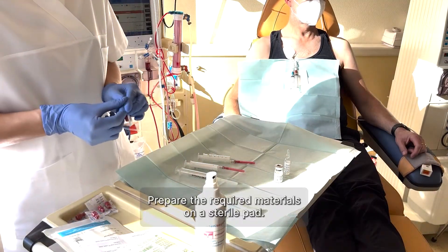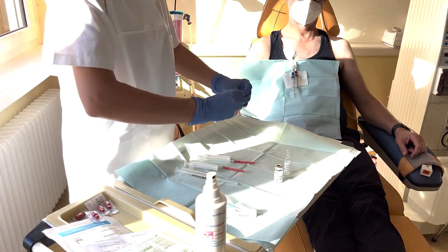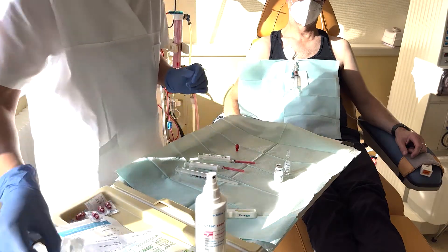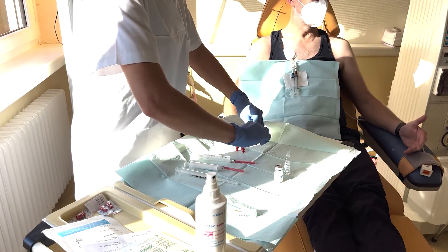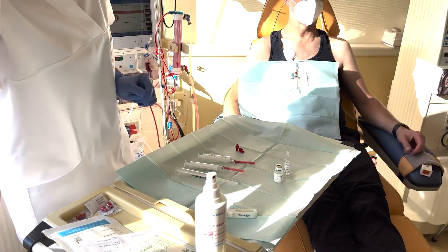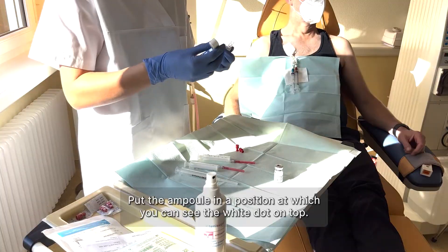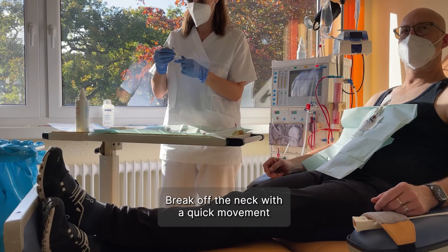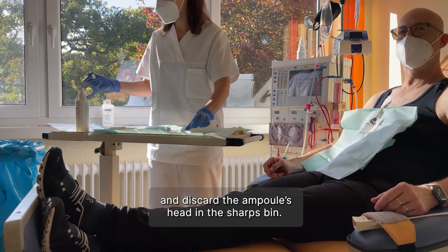Prepare the required materials on a sterile pad. Put the ampule in a position at which you can see the white dot on top. Break off the neck with a quick movement and discard the ampule's head in the sharps bin.